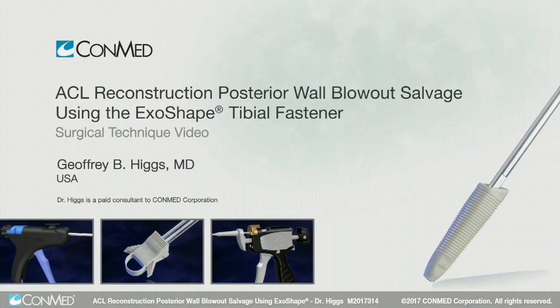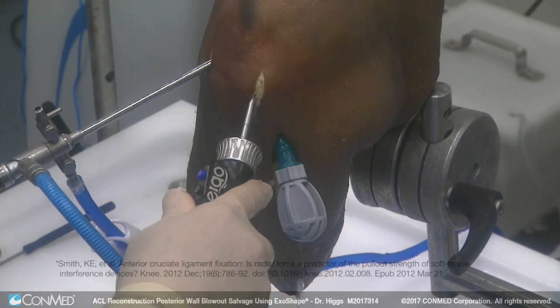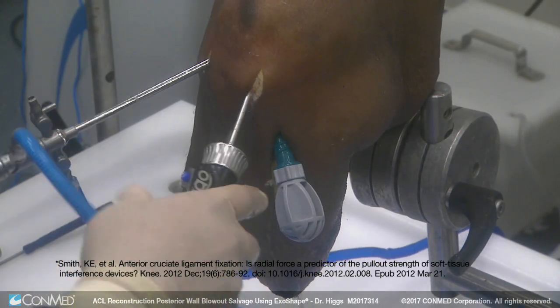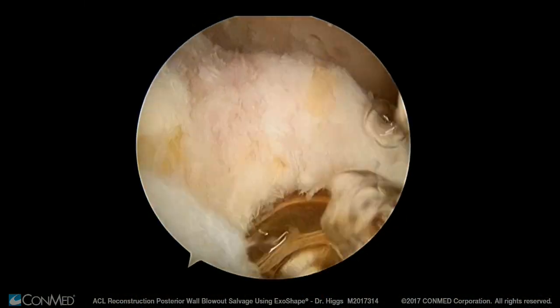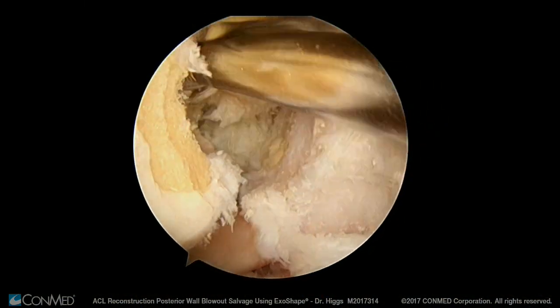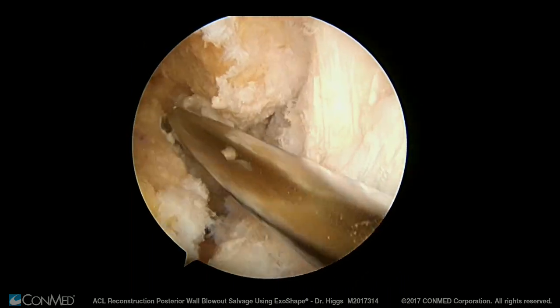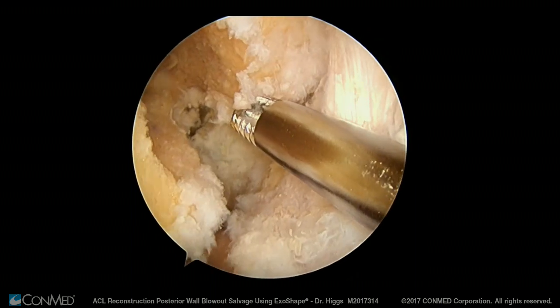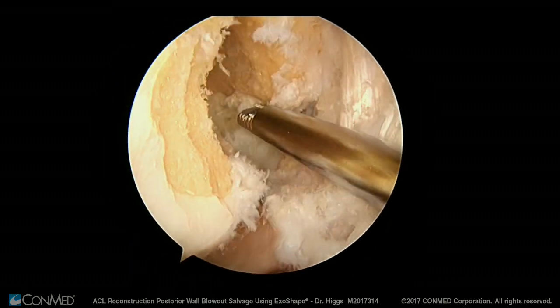With lack of posterior wall integrity, there's a good salvage technique to allow fixation to 1200 Newton's force on the femoral side. We've created our tibial tunnel and our femoral tunnel, but for some reason the surgeon blows out the posterior wall. This is a salvage technique using the tibial exo shape for fixation on the femoral side and tibial side as well.